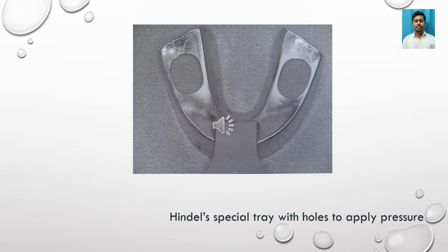So this is the illustration showing the modification of the stock tray given by Hindel, where the dentist is directly allowed to apply pressure in those particular holes so as to displace your residual alveolar ridge and get the proper functional form.